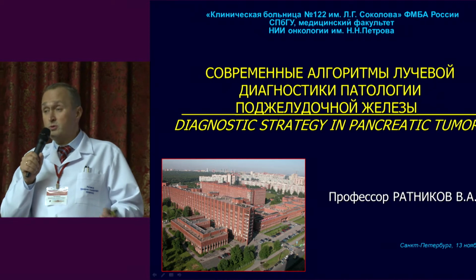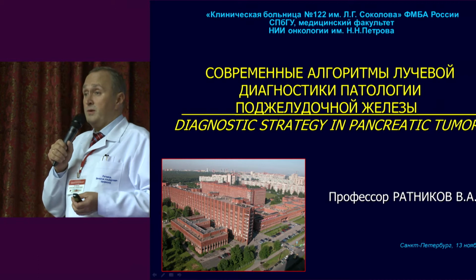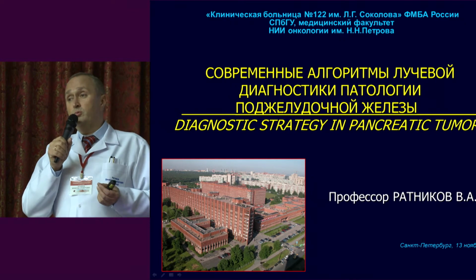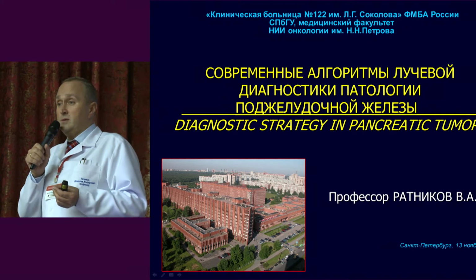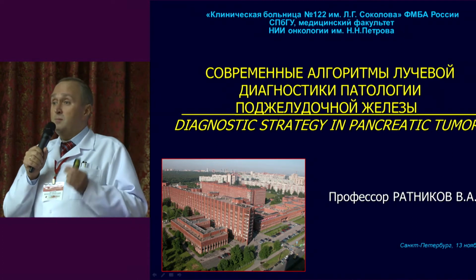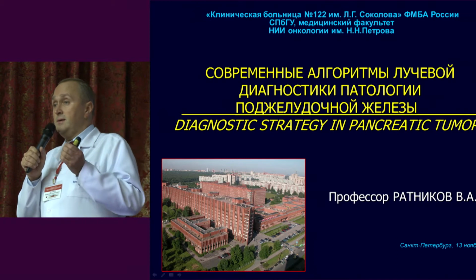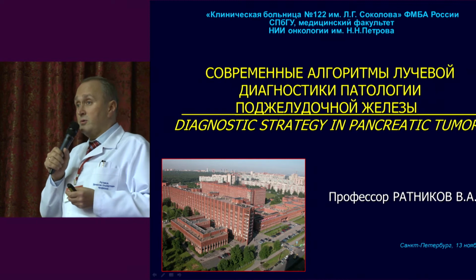And after such a wonderful presentation from the surgery, I'm going to speak about the pancreatic gland, but not about the bile tract. But if we speak about the length of the stump after cholecystectomy, to study the stump, of course, we should not be doing endoscopic ultrasonography. You can see it on MRI within 4 seconds without any anesthesia to the patient, without any preparation. The patient just holds his or her breath, and in 4 seconds you can say whether there is any dilatation of the stump and what the length of the stump is.